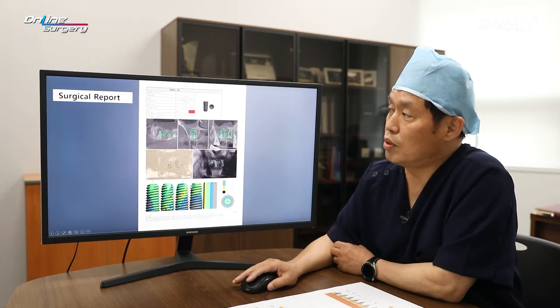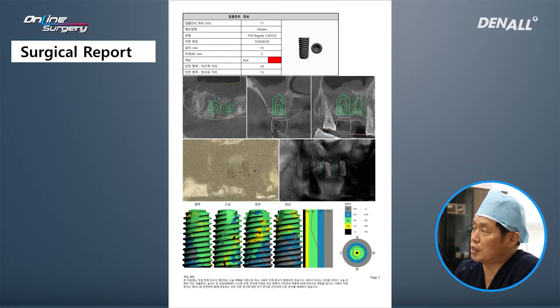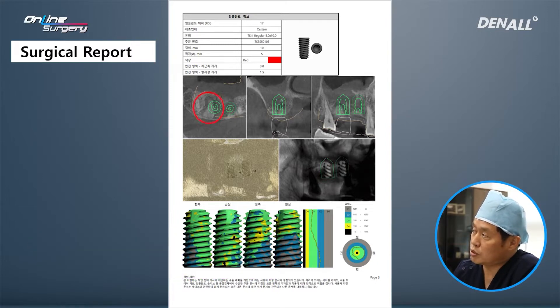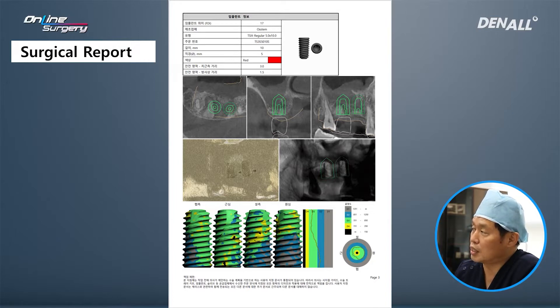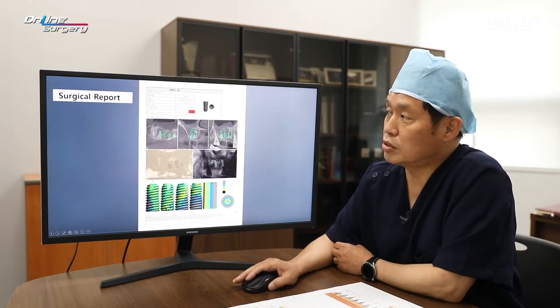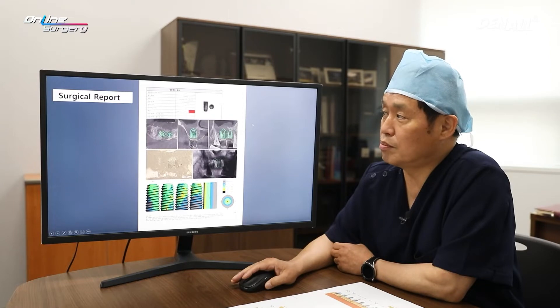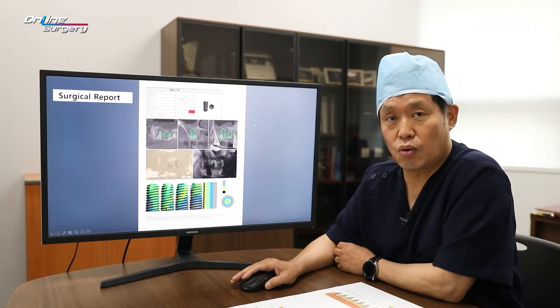In number 17, the one guided team anticipated there may be a need for bone graft due to slight sinus penetration because the residual alveolar bone was insufficient. However, I believe if we reduce the length to 8.5 mm, we wouldn't need any bone graft within the sinus. As mentioned earlier, there was socket preservation and bone graft done in the past. Bone graft material can be seen in the posterior area, and the bone seems harder because xenograft was used. In order to prepare for sinus floor penetration, one cast drill was determined to be used. In the posterior area, I decided on 8.5 mm to avoid sinus bone graft.